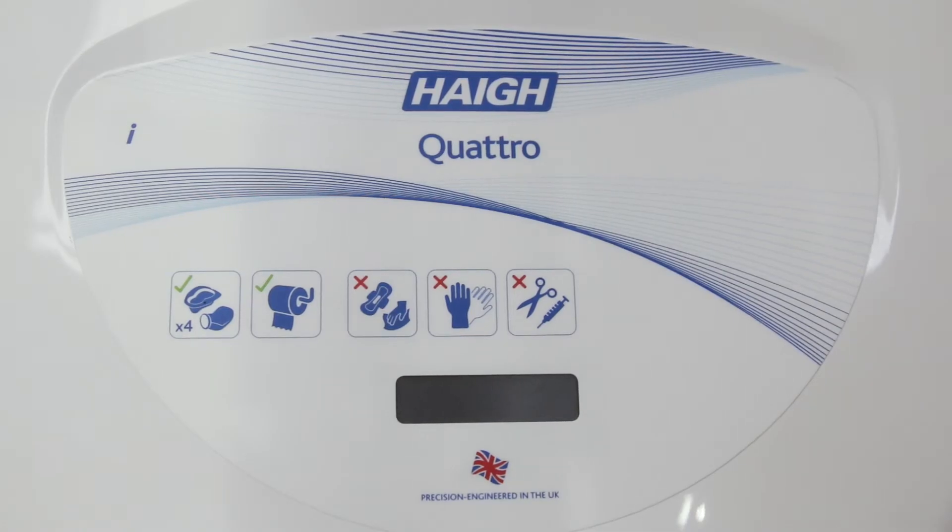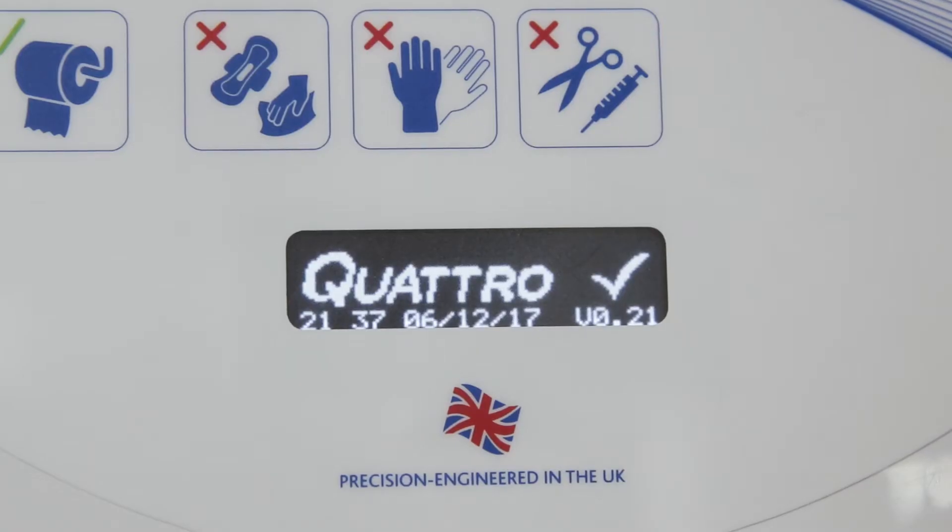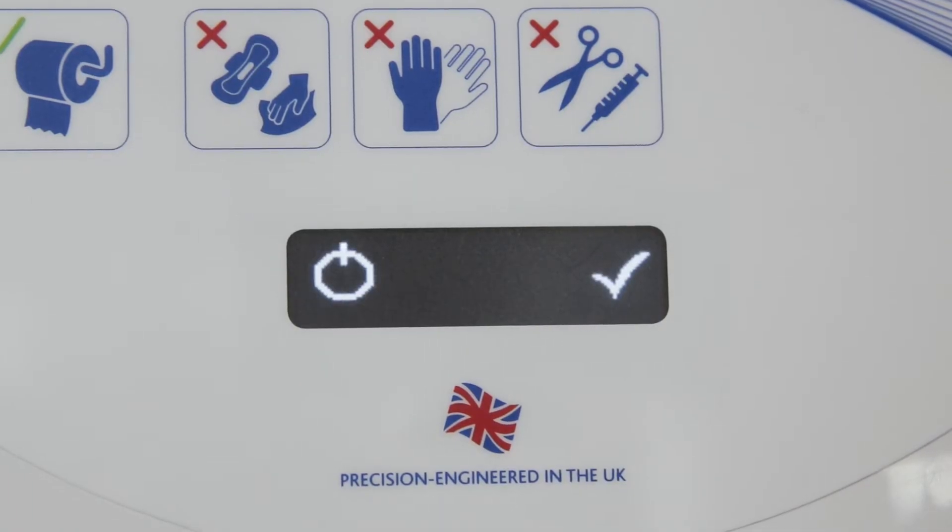When you switch on your macerator, the date and time will be displayed. If this is incorrect, please contact your facilities and estates department so they can correct it.